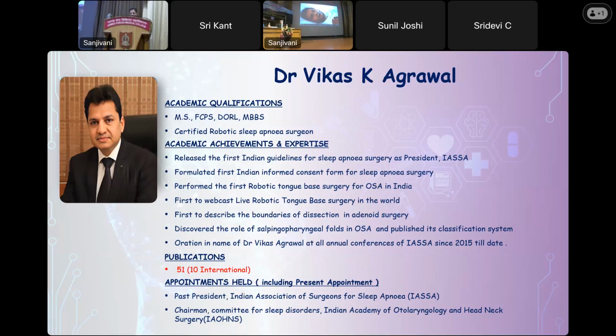Obstructive sleep apnea occurs when the soft tissues of the airway relax and collapse during sleep, blocking the airway and causing a drop in blood oxygen saturation. This causes the brain to signal a physical stimulation of the body to resume breathing, which results in a disruption of your sleep. The Belong Ring is an innovative technology that sheds light on your sleep health by monitoring your sleep patterns and pre-screening for obstructive sleep apnea, all in the comfort of your own bed. When worn during your normal sleep routine, the Belong Ring measures and records your body's biomarkers, including pulse rate, respiratory events, autonomic nervous system response, body motion, sleep stages, and blood oxygen saturation.